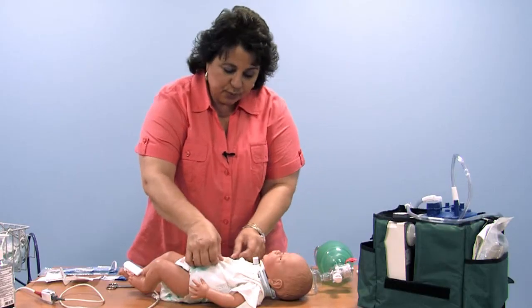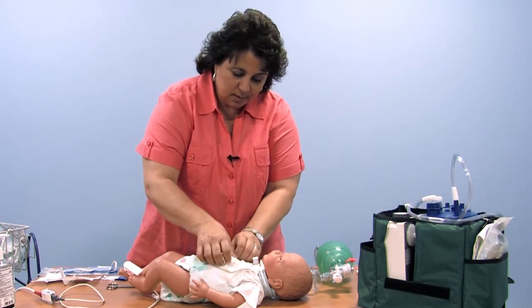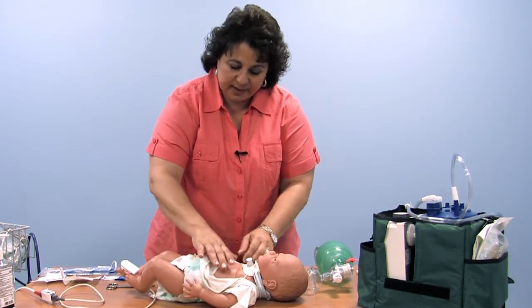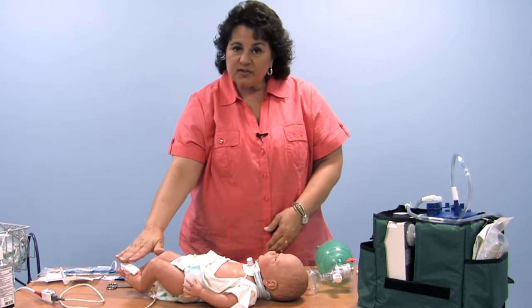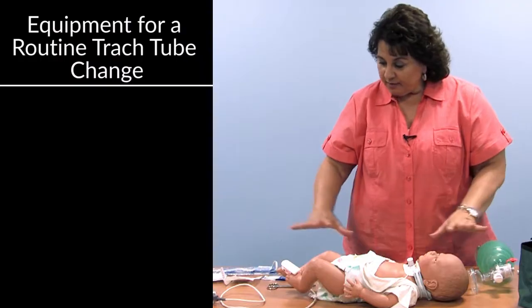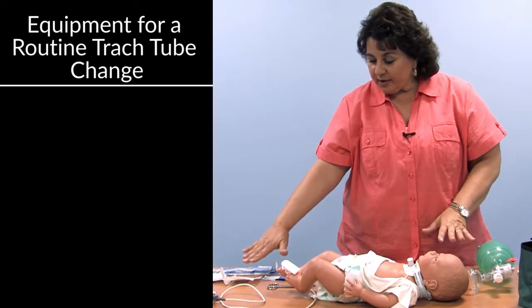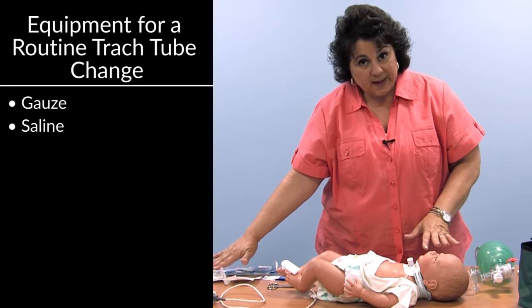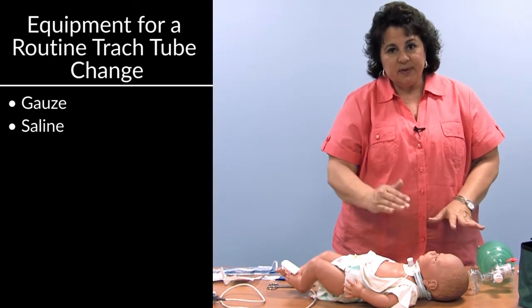We want to make sure that we either remove clothing or move it out of our way so that we expose the chest and we can see the chest. So now we have our oximeter on and working. We have our chest exposed. We have all our supplies here. We have our new dressing. We have gauze that we've moistened with a little saline so that we can use it to wipe the site.